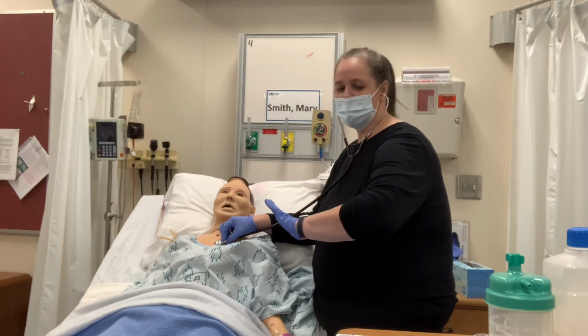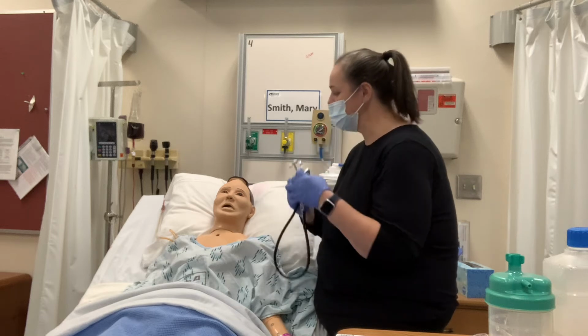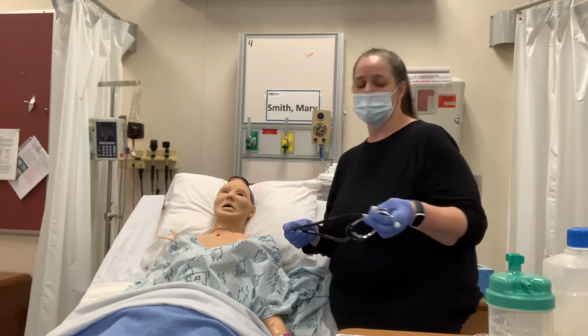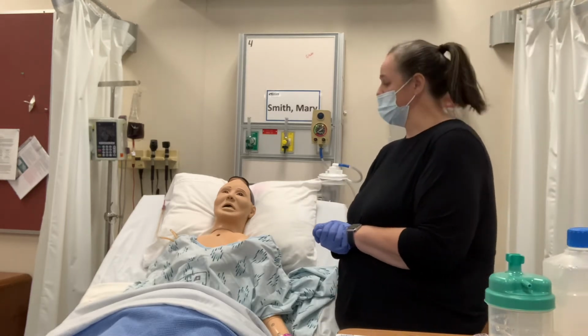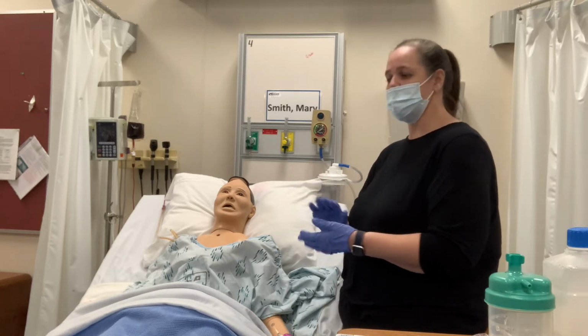So I'm going to simulate that time has gone by. Mary, it does seem like you're breathing a little bit fast. Your respiratory rate's about 22, and your heart rate's a little bit fast as well. It's about 105. Also, your oxygen saturations are a little bit low. It's only 91%.